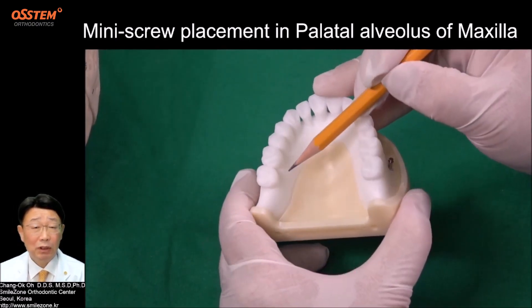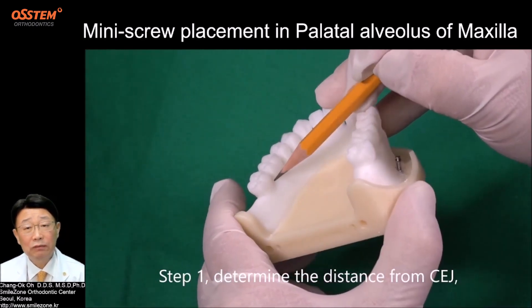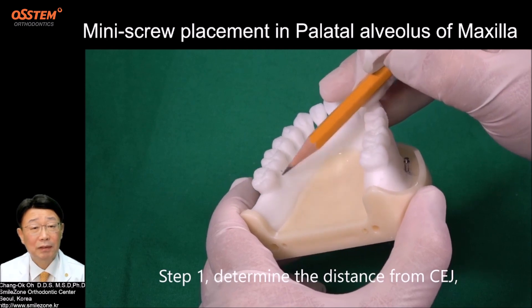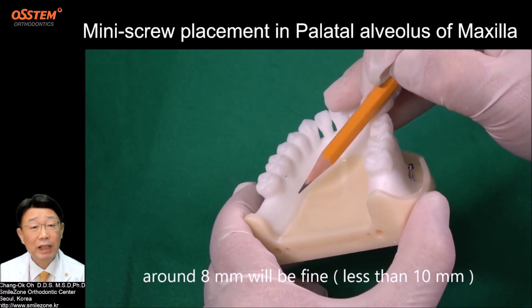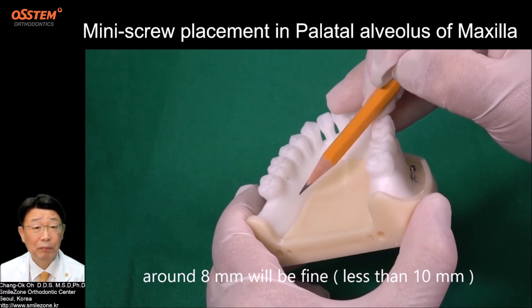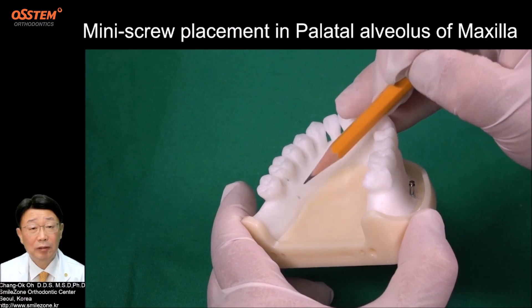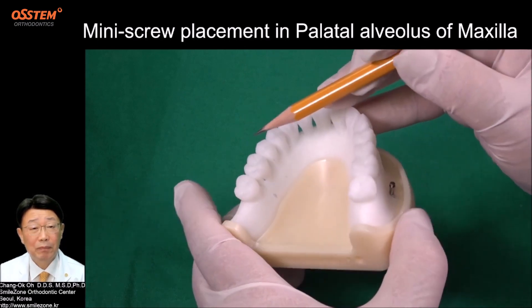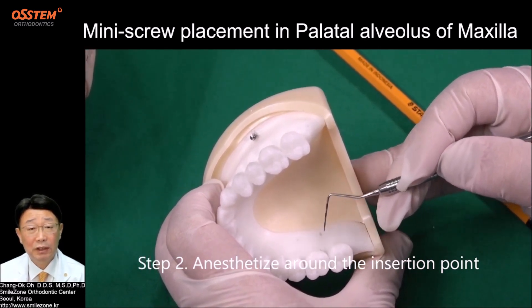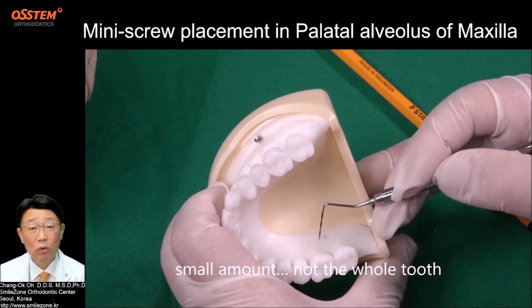Let's do it under typodont. Step 1: Determine the distance from CEJ. Around 8 mm will be fine, less than 10 mm. Step 2: Apply local anesthesia around the insertion point — a small amount, not the whole tooth.